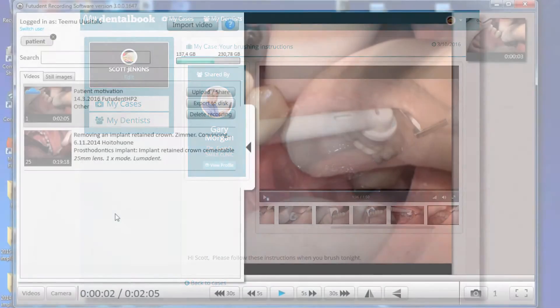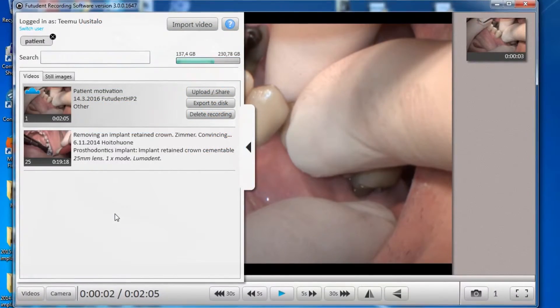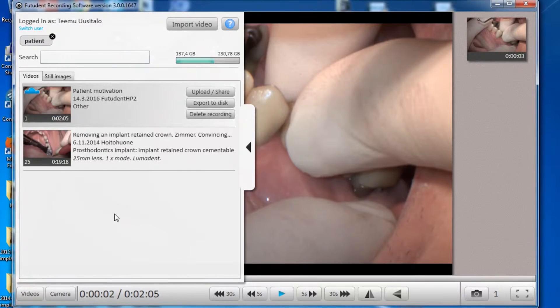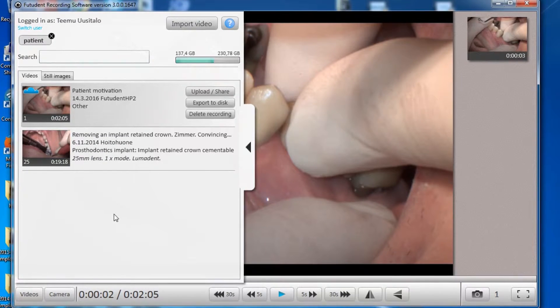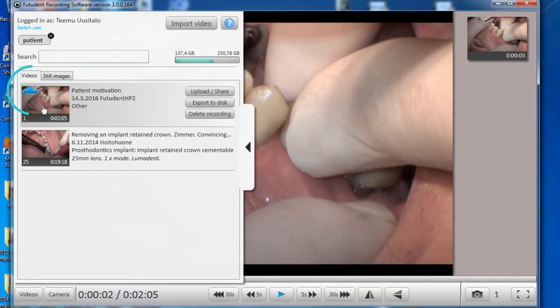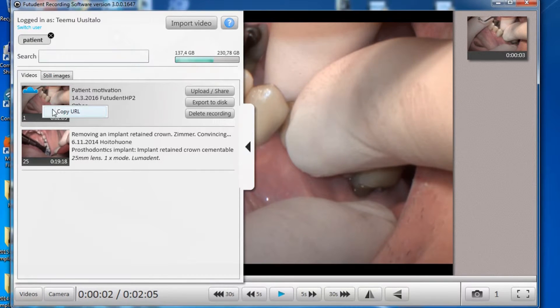You can also copy a link to the video into your patient's electronic file. After clicking upload, a blue cloud icon will appear over the video thumbnail in your gallery. Right-click on the cloud thumbnail and a link to the video is saved to your computer's clipboard.